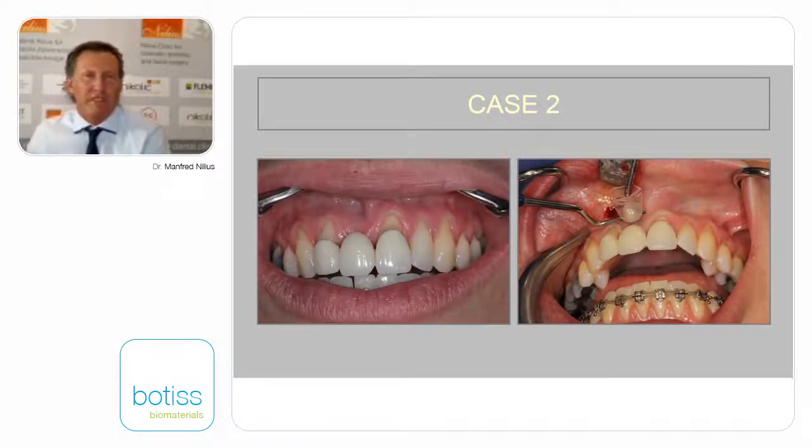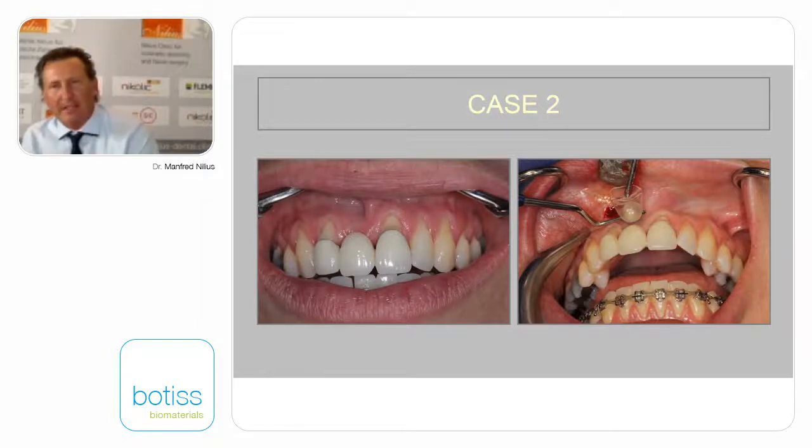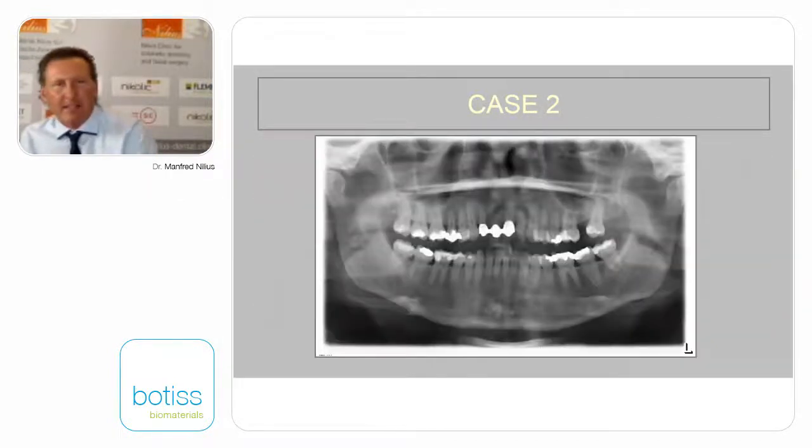This is the reason why we decided to recline a little bit the labial parts of the central incisors in the mandible. And before you make bone augmentation, there is a possibility to augment the soft tissue as well. This is the clinical finding or radiological finding.